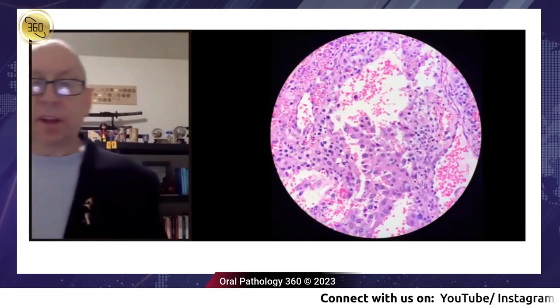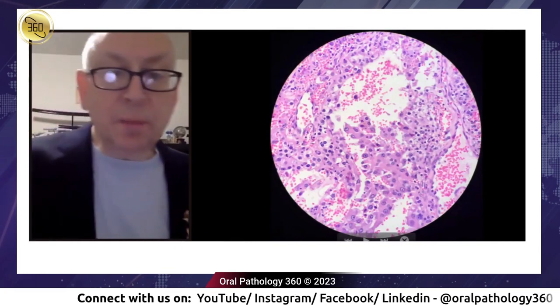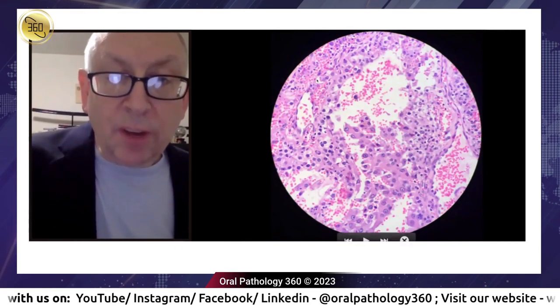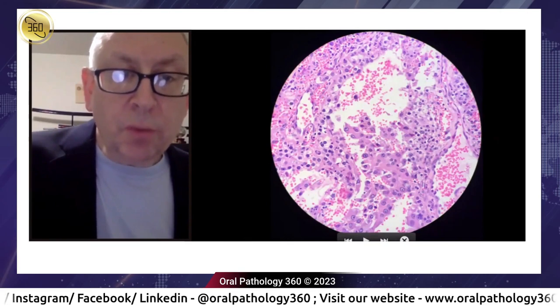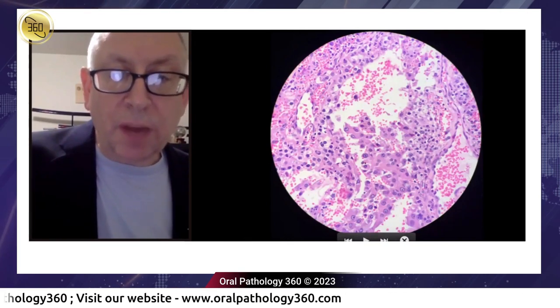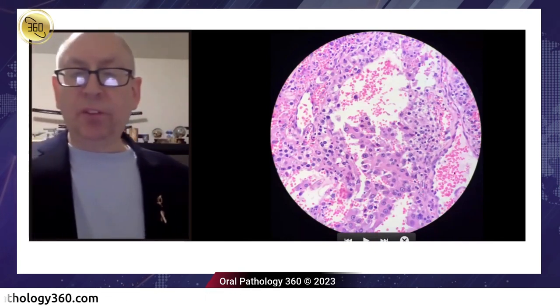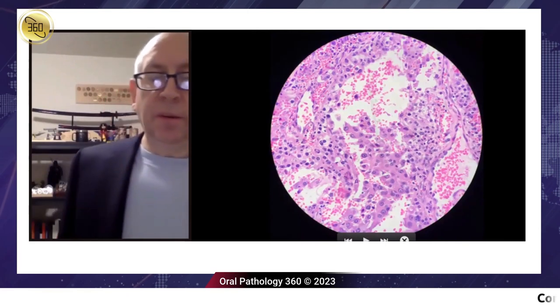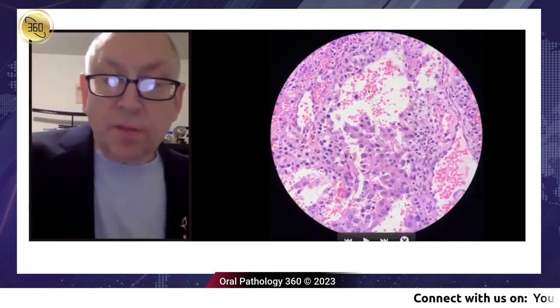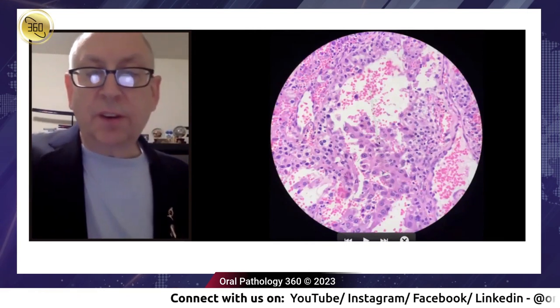Okay. Other areas, same thing. Very prominent nucleoli. And you can see some background cells, right? We'll just presume maybe that's a lymphoid cell. So the nuclei are just large, right? We use a background, there's small and large nuclei. There's blood vessels because the kidney is vascular. And again, I've added in the measuring device here.